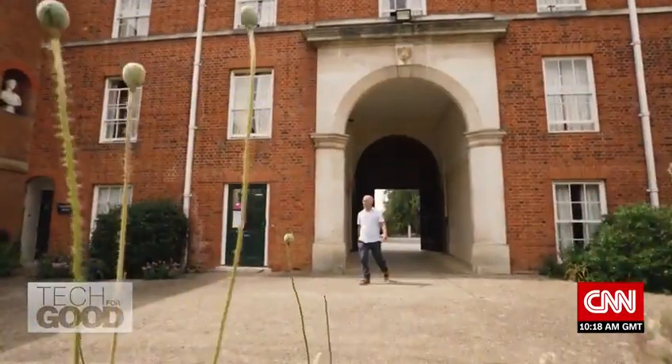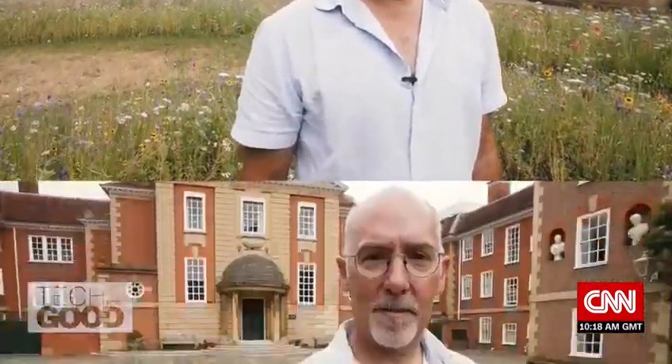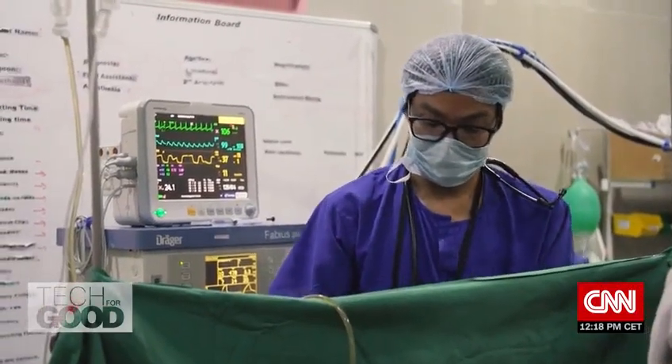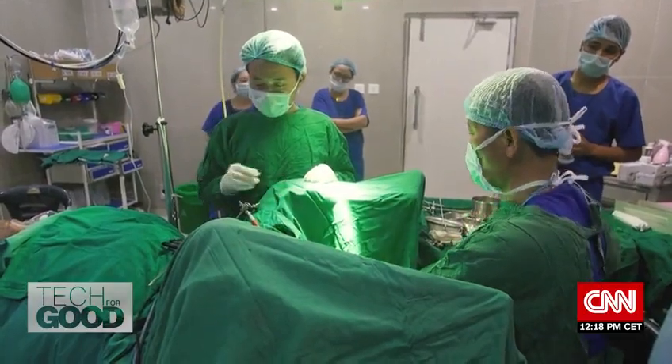For Oxford Professor Adrian Thomas, the prospect of using robots instead of a surgeon's scalpel is an exciting advancement in medicine. It's been tried and tested over hundreds of years, but the way that the medical profession — surgeons — operate inside of your body, it's still exactly the same. They get a blade and they cut you open. There must be a better way.